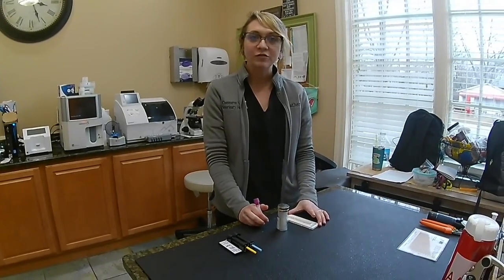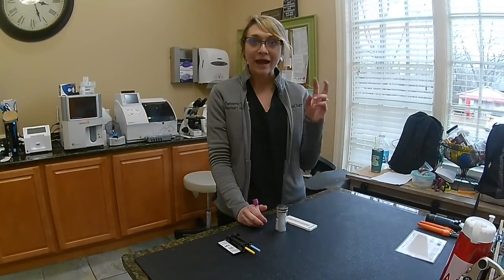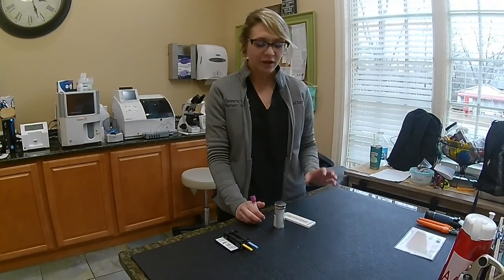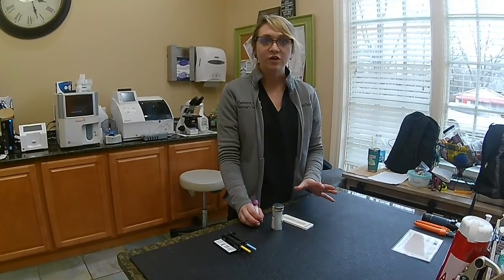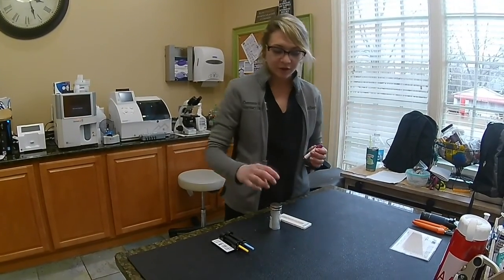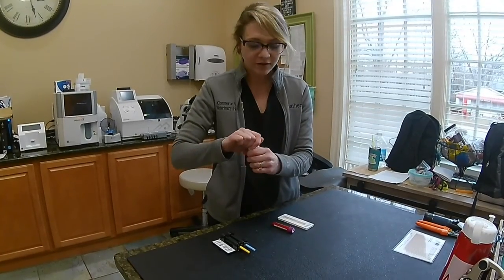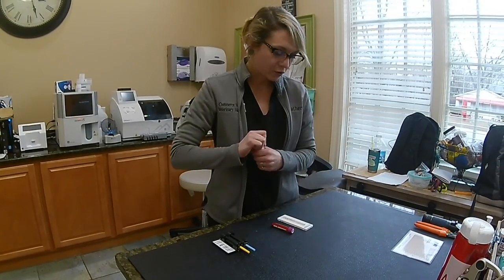Okay. All right, so for the next portion here, we're going to do a packed cell volume. In this instance, the cells that we're packing are our red blood cells. So this is going to give us a percentage of the red blood cells in our sample. So to start, we're going to fill these little capillary microhematocrit tubes. They're plain, so no additives.